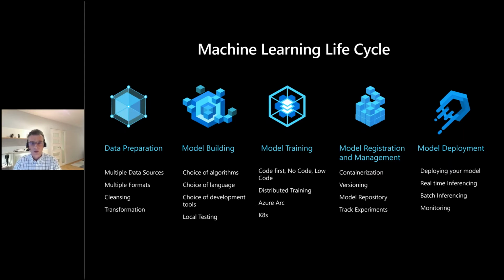Then after we have built our model, we have trained the model and have done all quality checks that are necessary, then we also, of course, need capabilities to manage the model, to deploy the model so that it can actually be used in medical settings. But the process does not end there. In real life, it's an iterative process, because when the model is in production, we want to understand if the data that we get, so the new images that are sent to the model in production, are there any issues? Is there data drift? Or maybe there are mispredictions.